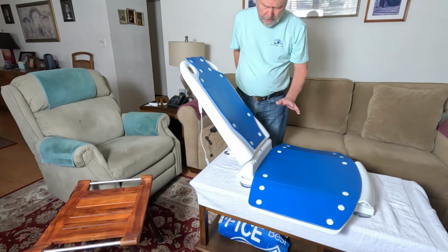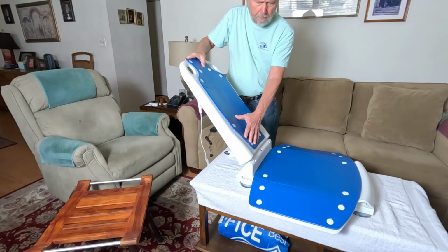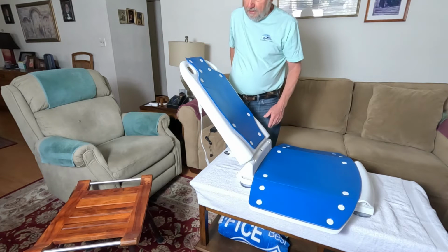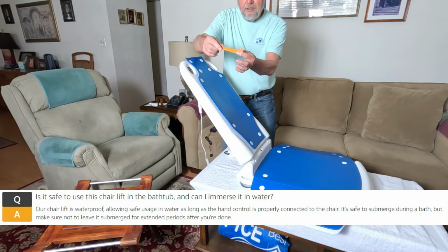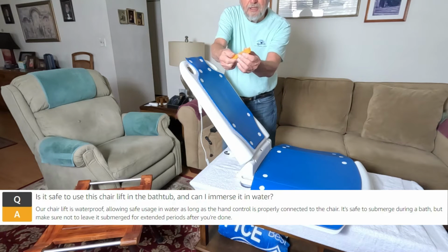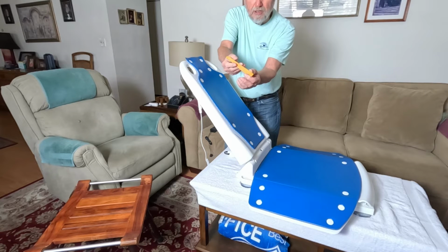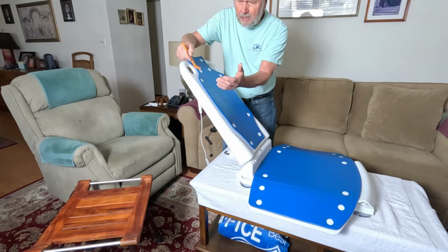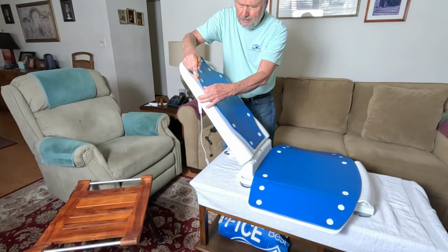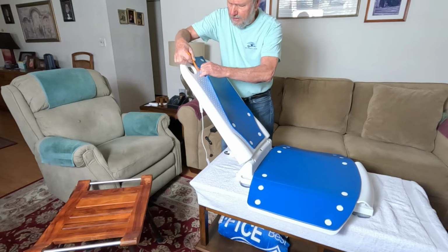Now, one other thing is this is a nice soft material and everything, but if you're going to use it in a bathtub and get it all wet, you might want to clean it. You can get tools like this that's just a piece of plastic, and it's a wedge shape with it strong on one end and just light on the other, or any other thing that can go into that point, and this will just snap right up.